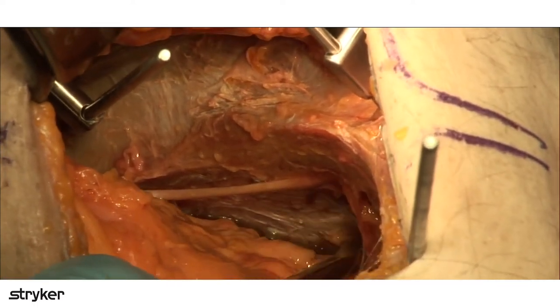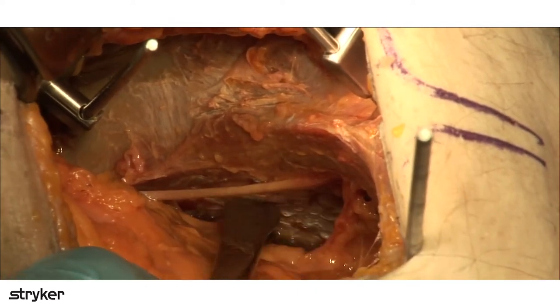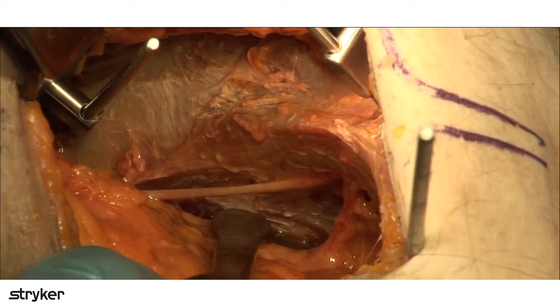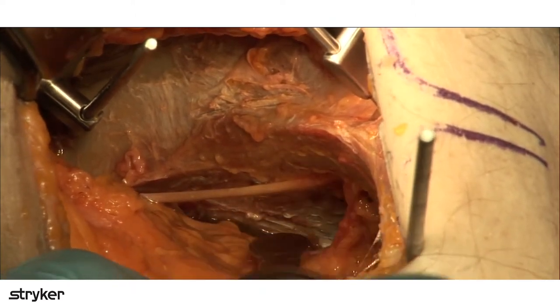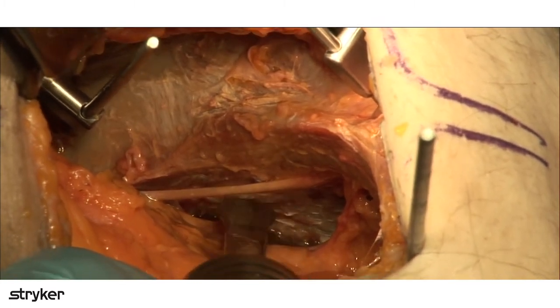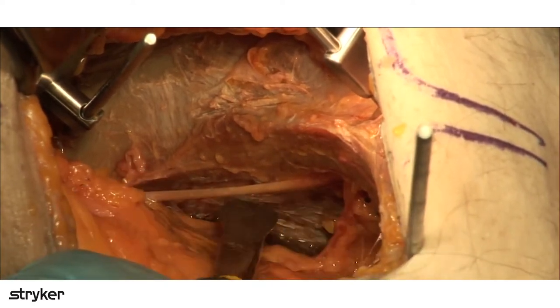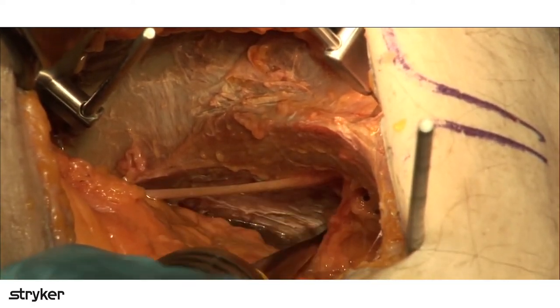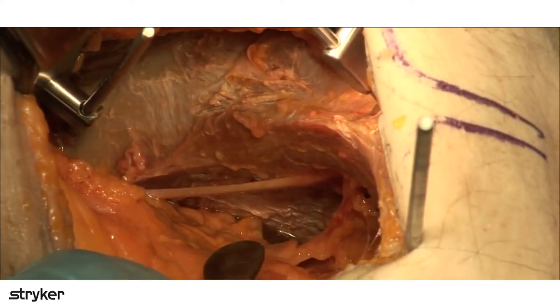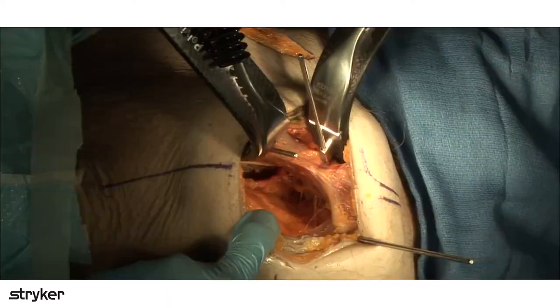Guy here has got a good paper on the safe zones with this approach, looking at your landmarks and where you're aiming into the joint and where you're not aiming into the joint. Fortunately, the trajectory that the soft tissues force your hand to be in actually aims you away from the joint in most of these cases. So this is all a nice safe zone for screw purchase. And if your fracture is high enough, you can easily plate the posterior column from inside the pelvis. All right, Mike, that's pretty much it that I want to show on the AIP here.